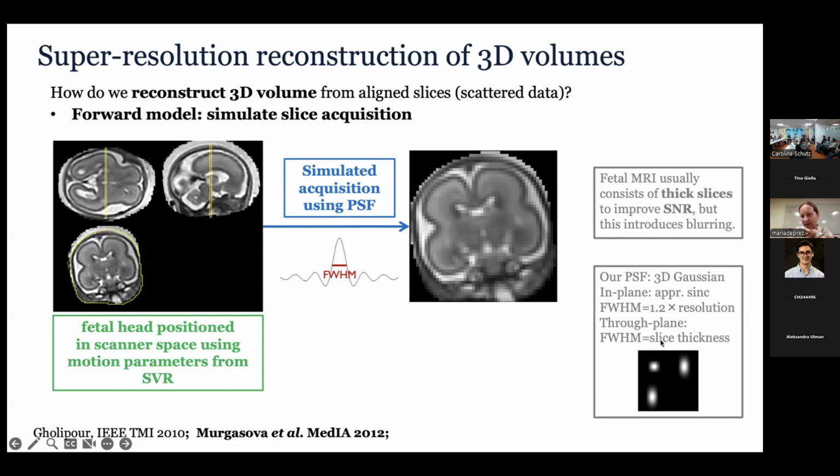And then the slice profile, we model as Gaussian. The reason for that is that we used to have Philips a lot, and actually they do have slice profiles that are very close to Gaussian. And I think the reason why it was good for fetal imaging is that it reduces the SAR. But I know that on Siemens it's probably not that Gaussian. We looked at that, didn't we, with Margarita? It's pretty Gaussian. Is it? It is pretty sloppy, yeah. Yeah, so I guess it does correspond to what we're using.